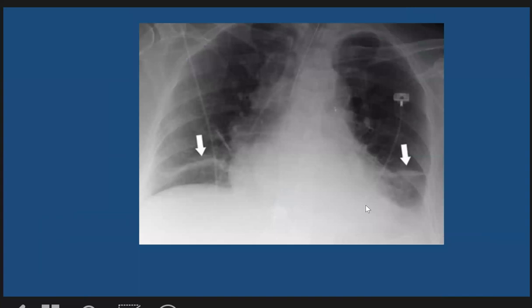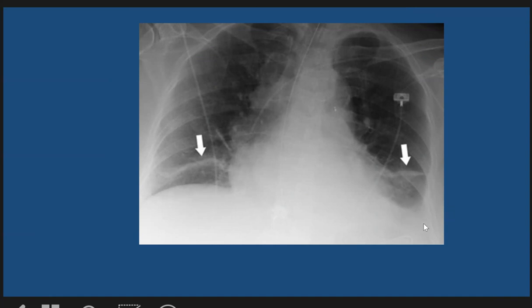Here is a patient with plate atelactasis, showing bilateral linear opacification at the lung bases adjacent to the diaphragm. There is also some minimal pleural effusion on the left side.